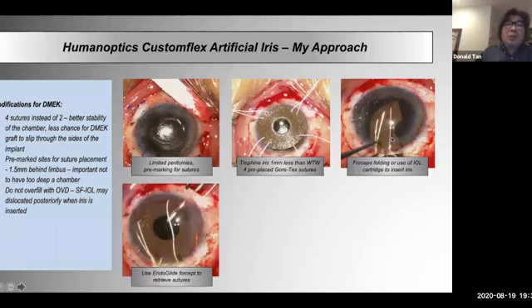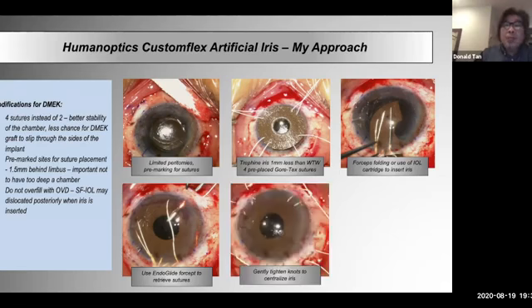What I use is the EndoGlide forceps. So I made pre-placed incisions with a partial thickness groove in between. And here I'm using the EndoGlide forceps. These are the forceps which you have to use with the EndoGlide, and they're standard 23 gauge forceps, which go through an MVR blade incision. And I basically then just pull the sutures out, retrieve them, and you tie them and just gently tighten and make sure that the implant is centered.